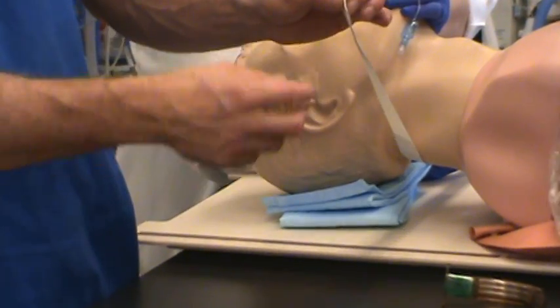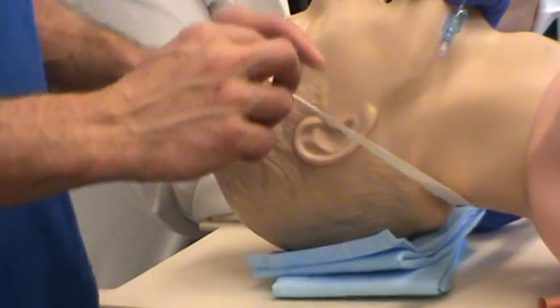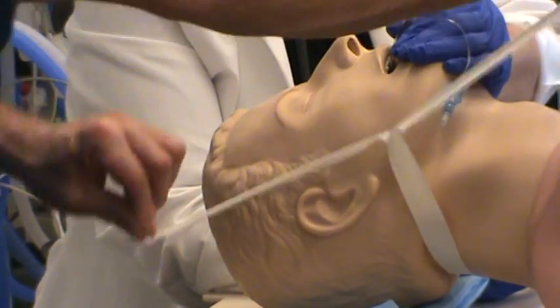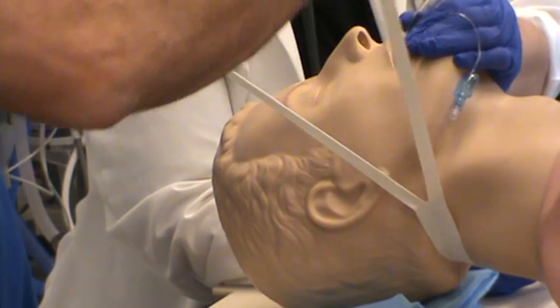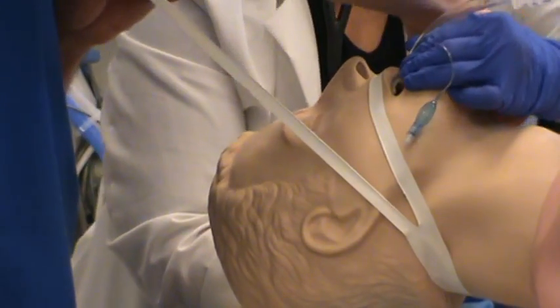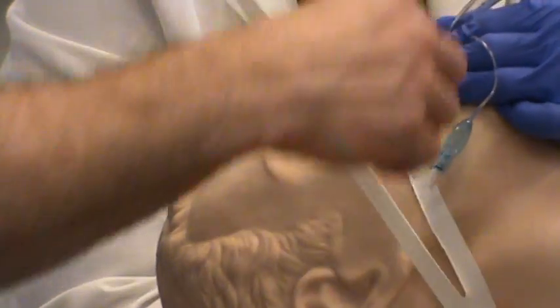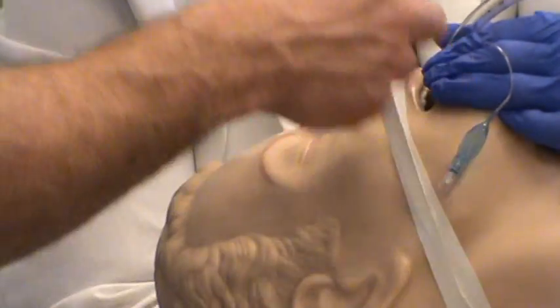The first thing you're going to do is tear the tape. Make sure the double-sided portion stays underneath the patient's neck. We're simply tearing the tape — this is not your skin ripping. Take the bottom tape in your right hand and bring it over top of the patient between their nose and their mouth, going onto the other side. Ensure that you're going below their earlobe and that the tape doesn't go on the earlobe.